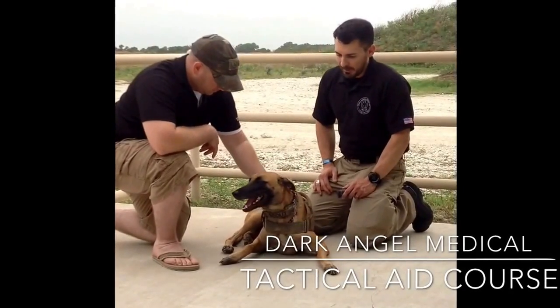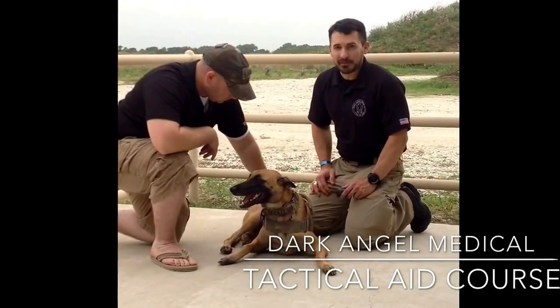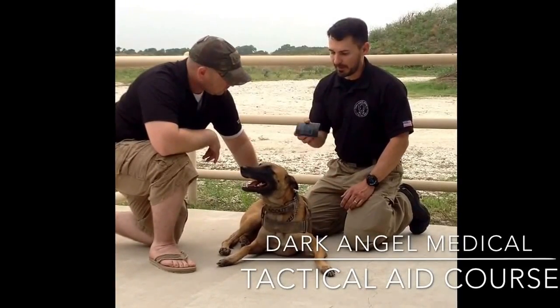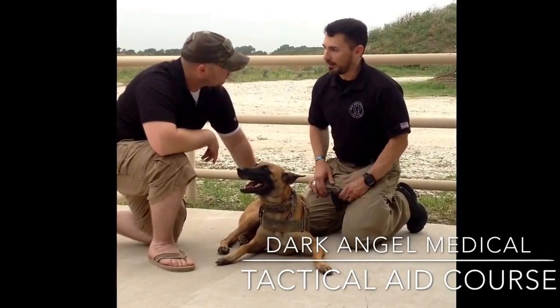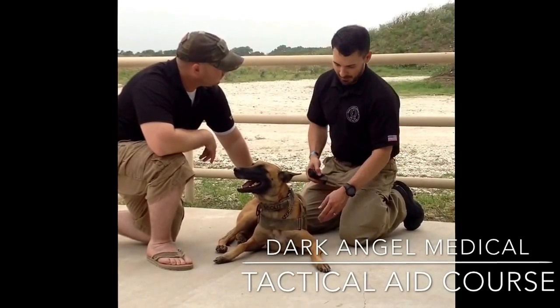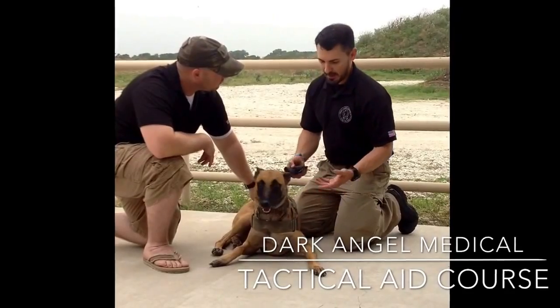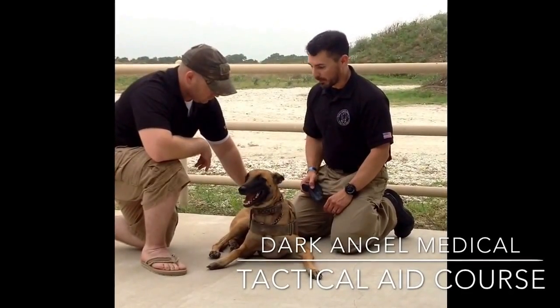The big thing with applying a tourniquet to your canine is choosing the tourniquet that's right for their size. One of the best I've found is the SWAT-T — the Stretch, Wrap, and Tuck tourniquet — because you've got these little legs; you don't have the big muscular limb like on a human being. It also works great for kids and small adults.